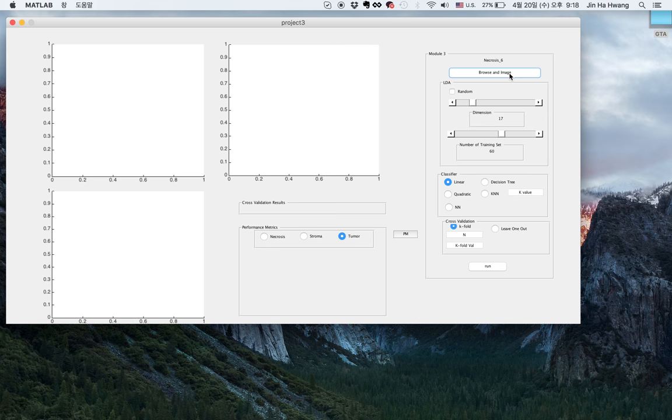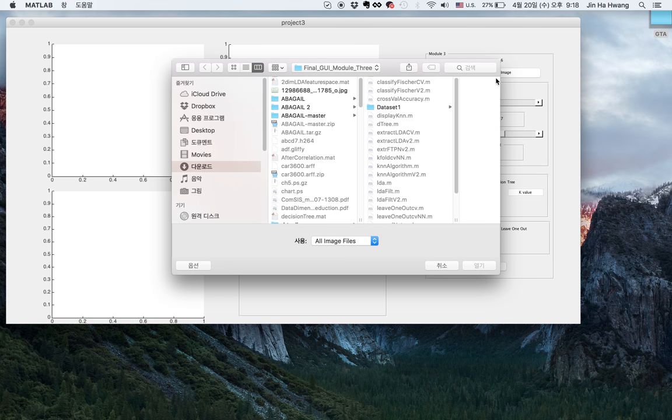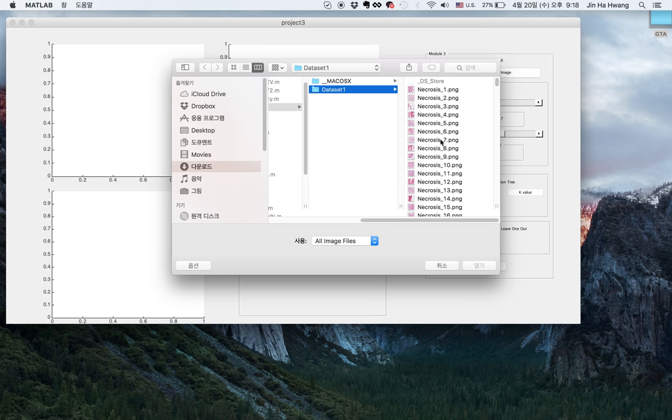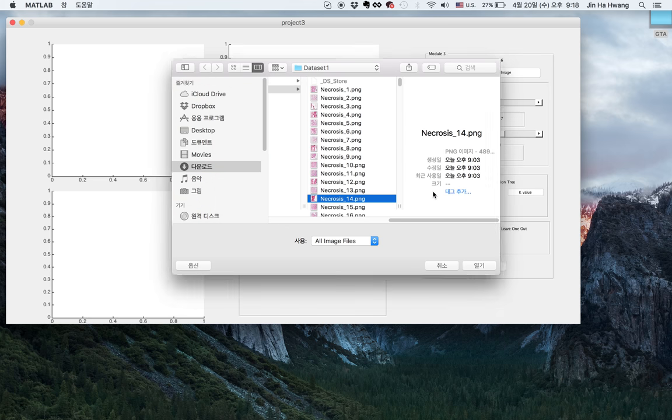First, this is a browse image. You can browse any image from the dataset folder we have, and we'll choose Necrosis 14.